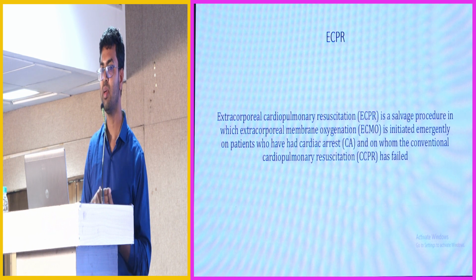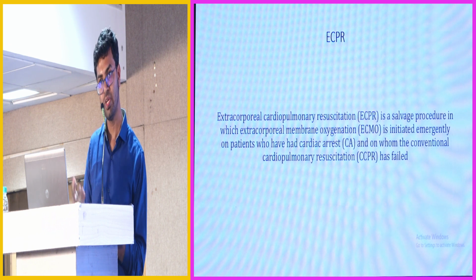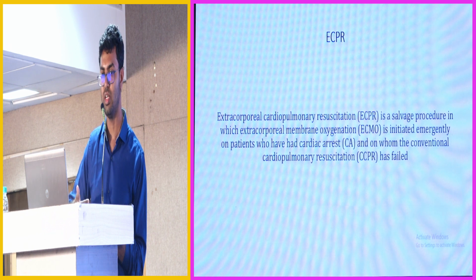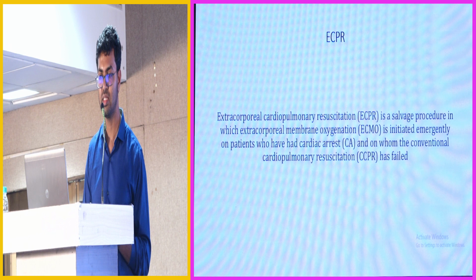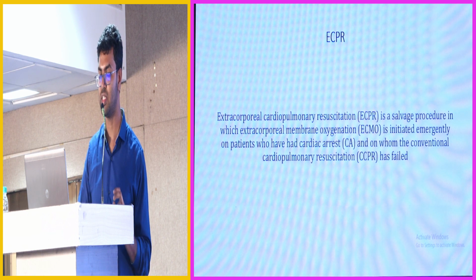So it is a special type of veno-arterial ECMO, called extracorporeal cardiopulmonary resuscitation. It is a salvage procedure in which ECMO is initiated in a patient who you are doing CPR on and you are not able to achieve a return of spontaneous circulation. The heart has not started beating or pumping, but you are doing good quality CPR. It has been already 20 minutes, but the blood is not coming. Then if you have facilities, you can put on ECMO while doing CPR itself. That saves the patient.